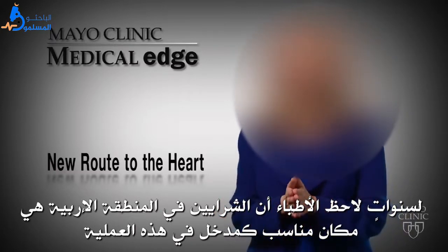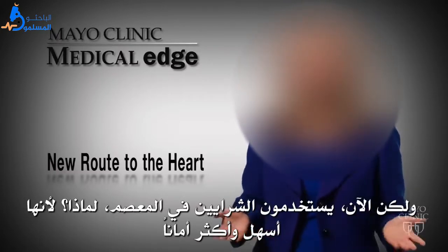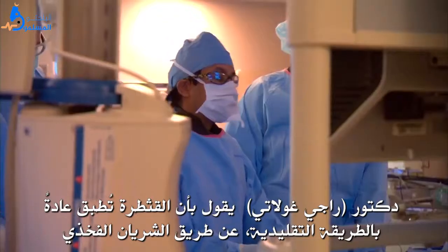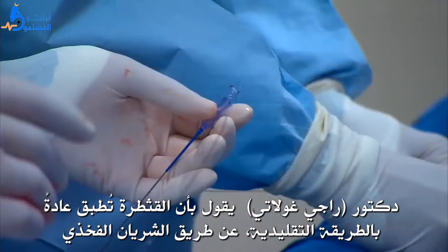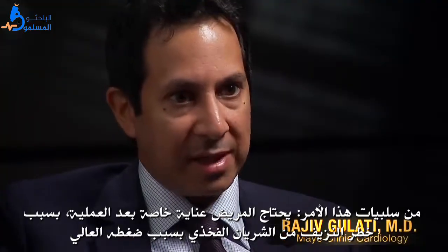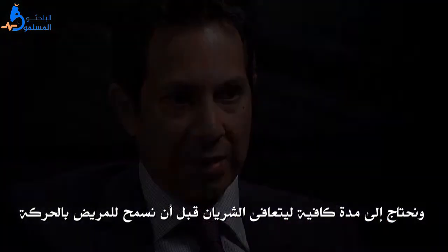For years, doctors have used the artery near your groin as an access point for this procedure. But now, some are using the artery in your wrist — because it may be safer and easier on patients. Dr. Rajiv Gulati says most of those stents were placed the traditional way, via the femoral artery. The downside is that patients often need to lie flat for a number of hours after the procedure, because there is a risk of the femoral artery bleeding since it's under high pressure, and we need to allow the vessel to heal up before the patient can move around.